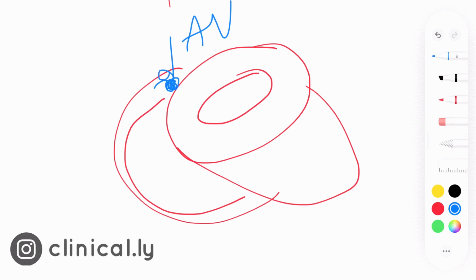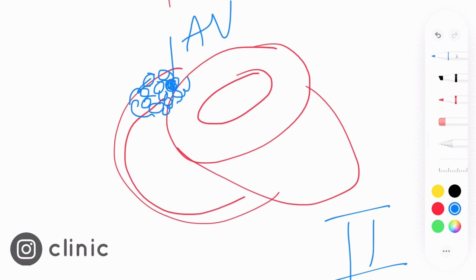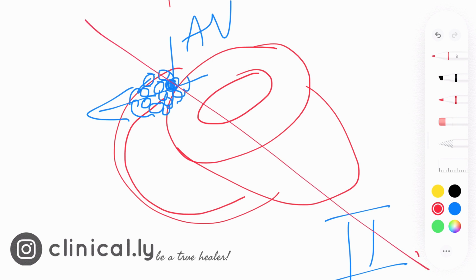initially the cell to cell movement of the activation wavefront begins. So in lead 2, when the activity is going in this direction, so this is our lead 2, and here the activation is going towards this side.